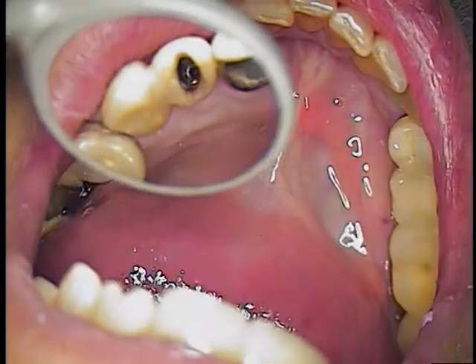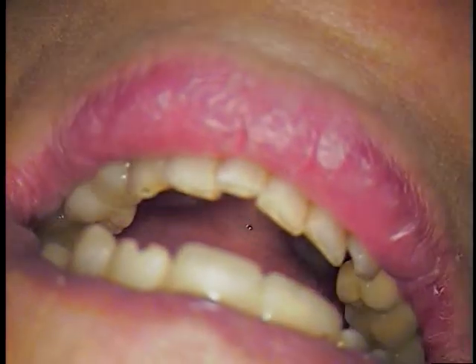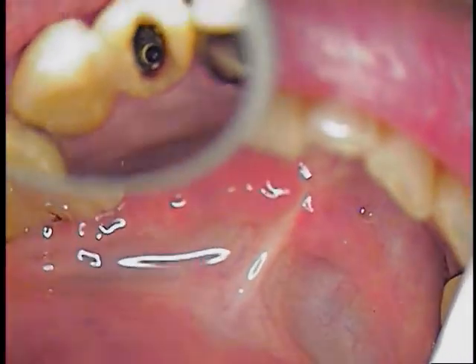Yes, thank you. All right. Clean out the threads. Let me go ahead and just suction out the metal filings. A lot going on here. Let's give her another bite. Close down, close. Thank you. Stay close. Good job. Okay.